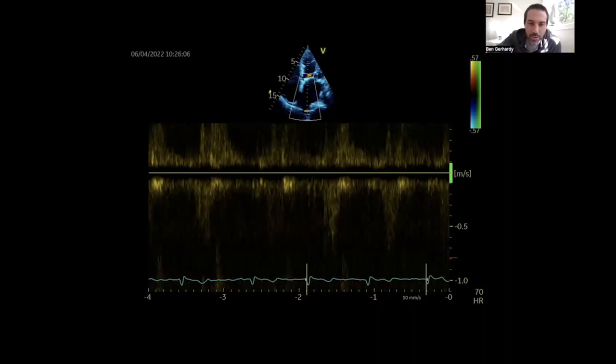So I think there's a few things we need to do to improve this image. In terms of the alignment, from what I can see in the B mode above it, that looks quite good. We're quite down the gun barrel of it, so to speak. I take the low pass wall filter off so I can see better how things line up. I would change the sweep speed to only have 3 cardiac cycles. And then I would increase the gain a little bit. I don't want it to be overgained, but I think it could be increased a little so I can try and work out where the bottom of those waves is. Yeah, nice. And sometimes reducing the depth, putting some color into that pulmonary vein, reducing the scale right down, and then increasing your actual sample gate volume to about 4 millimeters can help optimize it.